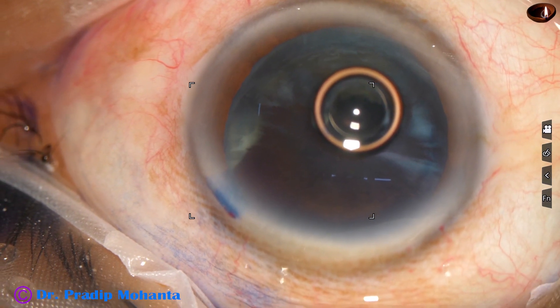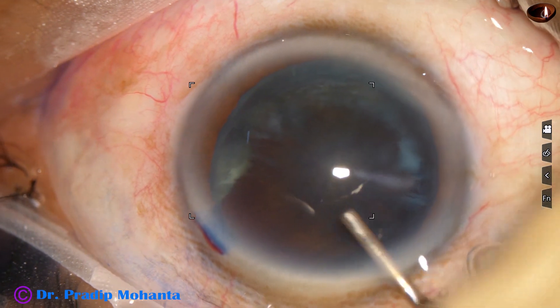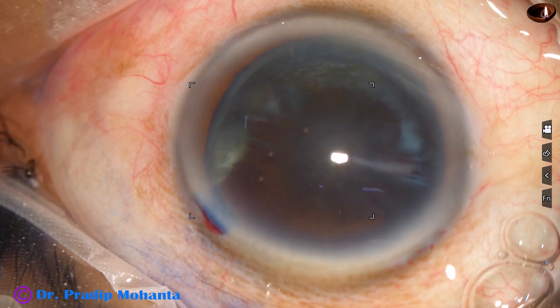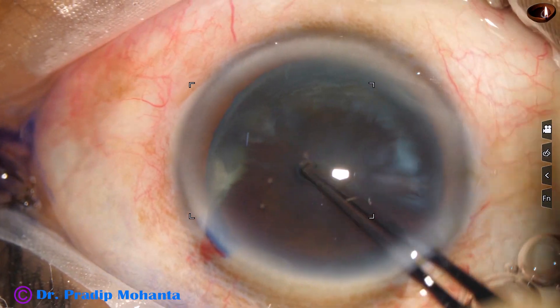However, we can also stain the anterior capsule without using an air bubble. Then the anterior chamber is filled up with 2% hydroxypropylmethylcellulose.